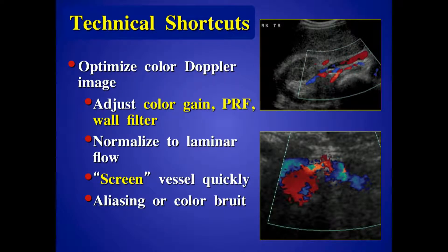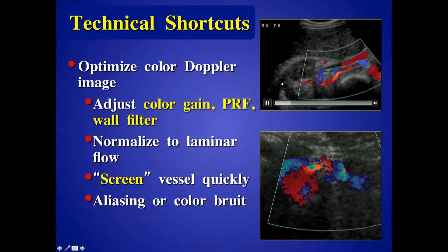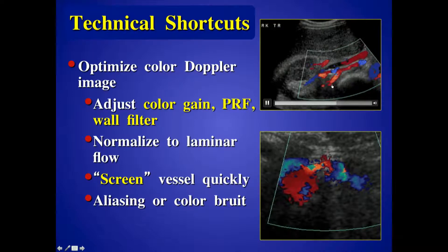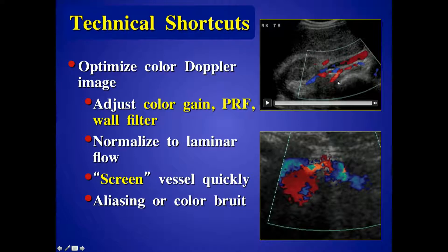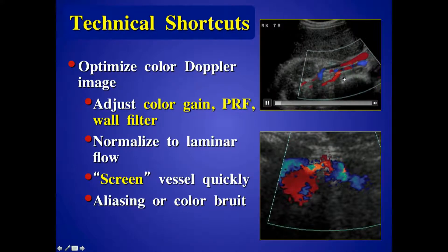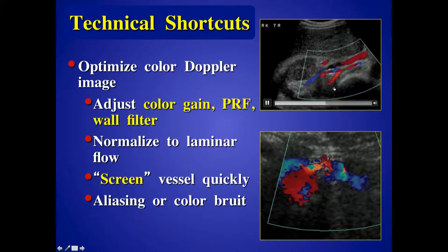Here's another look at the right renal artery, very well seen. No aliasing, no flow disturbance — so we have a really good idea there's no underlying stenosis even before we get our Doppler velocity measurements. In this particular case, we also notice early branching of the renal artery. Nice to see those anomalies right away.